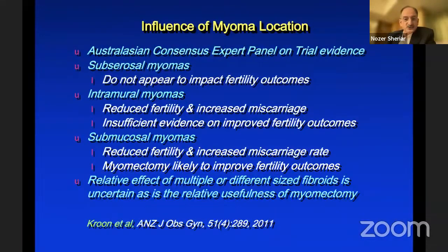The one other thing I'd like to talk about, retained products of conception with medication abortion. Just leave them alone for long enough and most of them will clear. It is the type 2 and the type 3 that persist, which require your intervention. And that's where hysteroscopy probably again would be a gold standard.